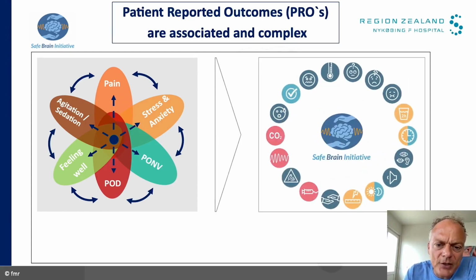And we know that there's no single bullet solution for improving patient-reported outcomes or postoperative delirium. It's always a bundle of measures that has to be introduced. Most of this information is from the ESA guideline on the prevention of postoperative delirium, now called ESAIC, of course. One of the recommendations from the ESA is the usage of EEG monitoring intraoperatively to decrease the incidence of postoperative delirium.